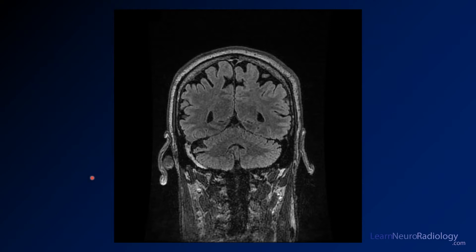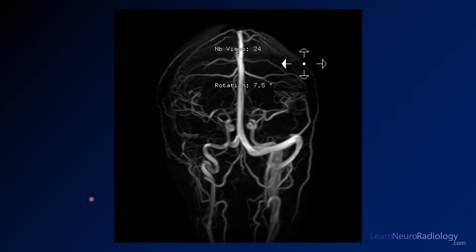On the FLAIR image, this transverse sinus or transverse-sigmoid junction is T2 hyperintense compared to the other sinuses, so you see that the right sinus is abnormal. On the MR venogram portion, you're missing the entire transverse and sigmoid sinus on the right, whereas you have the transverse, sigmoid, and jugular on the left — so that drainage is absent on the contralateral side.